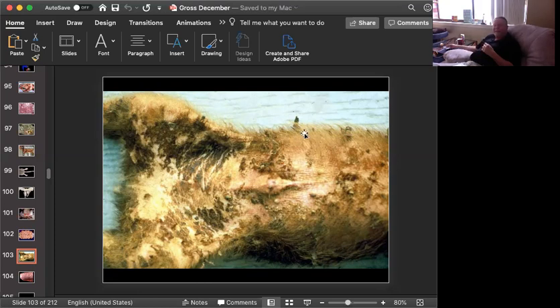It's an epidermal lysin. Some people say it's related to staphylococcal scalded skin syndrome in people, but this toxin that is elaborated by Staph hyicus causes necrosis of the very superficial layers of the epidermis. You have infiltration of neutrophils, and the underlying dermis really has very little going on. So it is a true exudative epidermitis, and that's what I call it, the morphologic diagnosis, exudative epidermitis as well. A great case in which the name of the disease is very suitable for morphologic diagnosis.